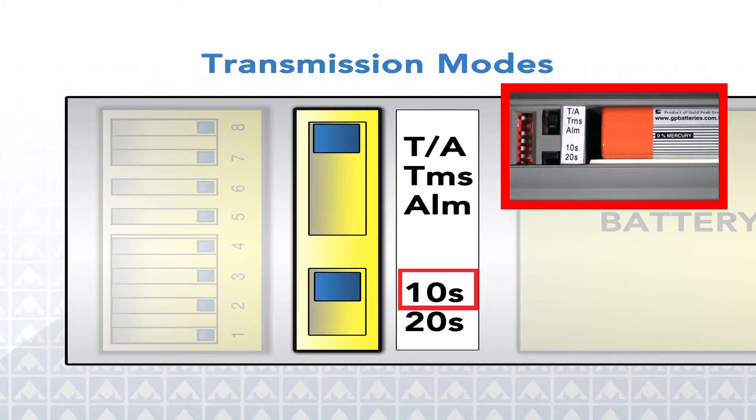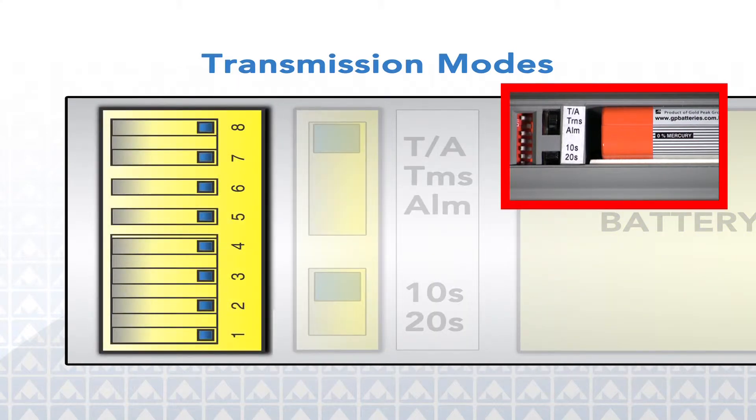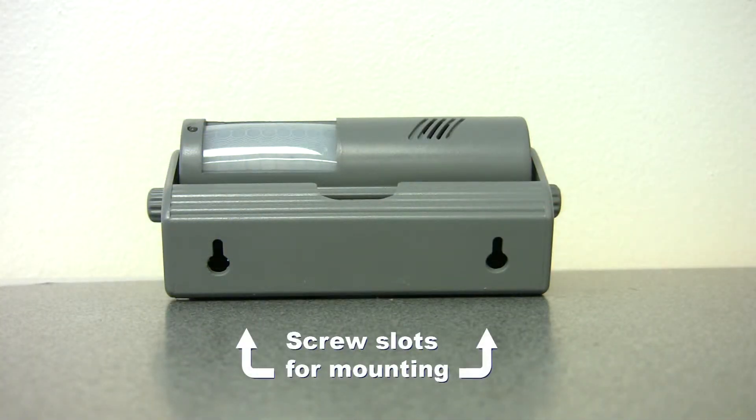Just below these controls is the delay function selector. Choose either a 10 or 20 second delay that allows the caregiver to exit the room without disturbing the sensing field. The eight position red and white dip switches indicate the channel the transmitter or receiver is set to — they are numbered 1 through 8. On the bottom side of the holster are the screw slots for mounting the device.